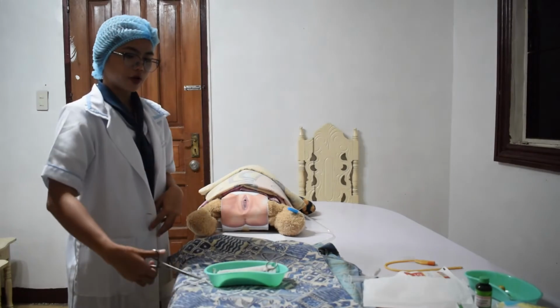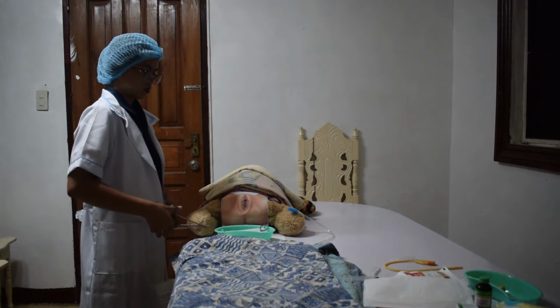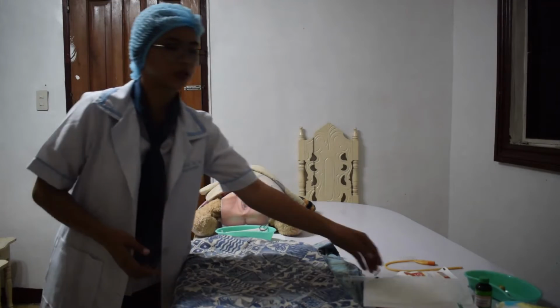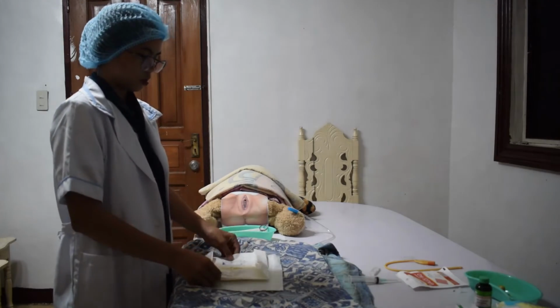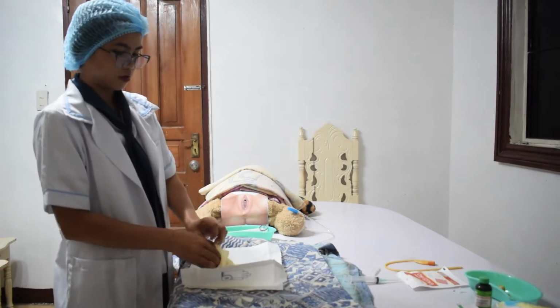Place the sterile drape between the legs. Put on sterile gloves in the following sequence. First, glove the dominant hand only.